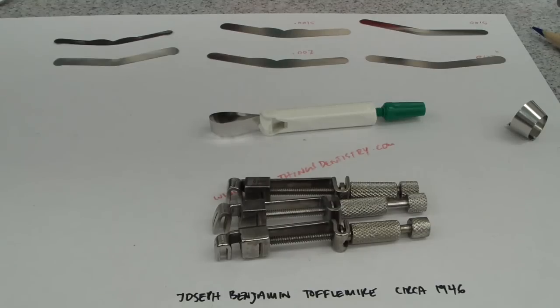Now amalgam is controversial and slowly it's going away, but some of the key factors in amalgam placement, especially the matrices, can be used for composites.